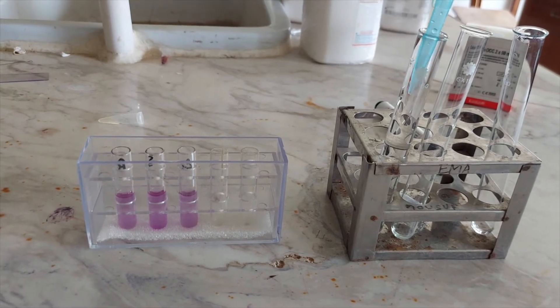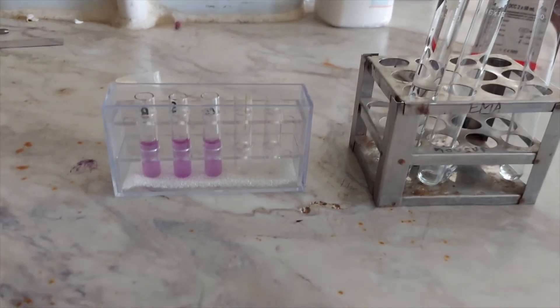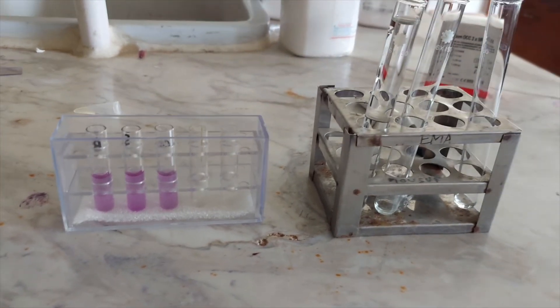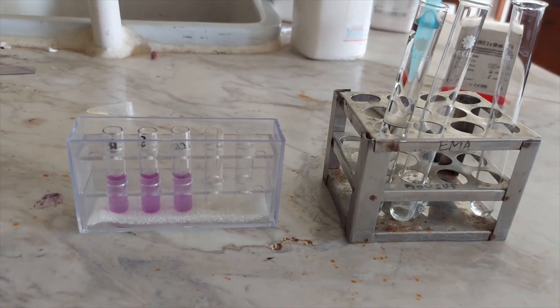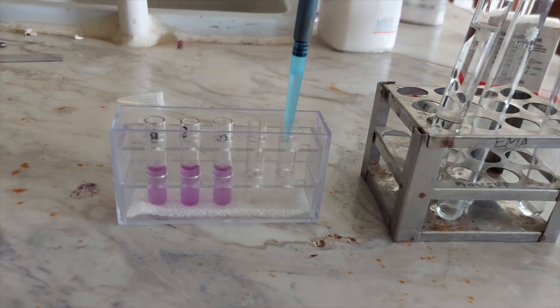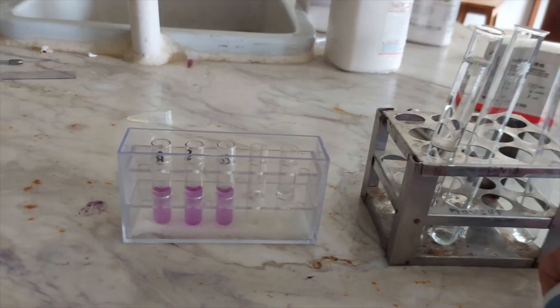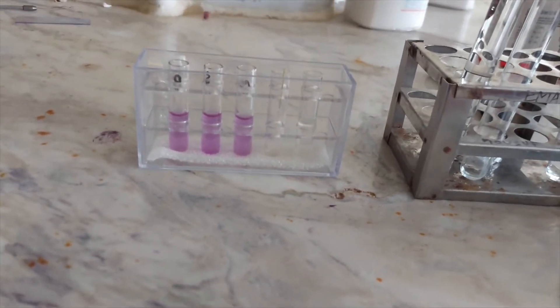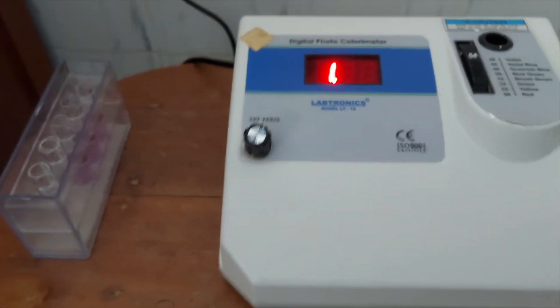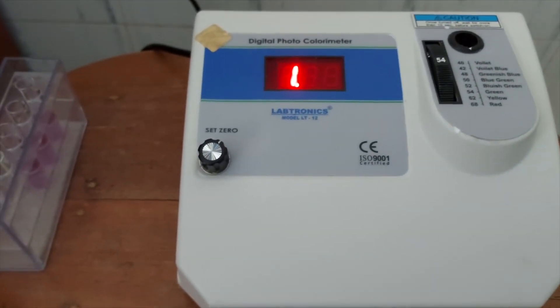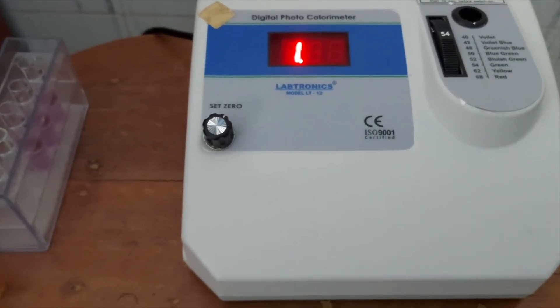In another cuvette, we are going to take distilled water for the calibration of the machine. We have to remember that this is a two-step calibration test, so we have to calibrate the machine first with distilled water and then with the blank reagent. Now we will leave the reagents for two minutes. In the meantime, we are going to turn the machine on and wait for five minutes as mentioned in the protocol.